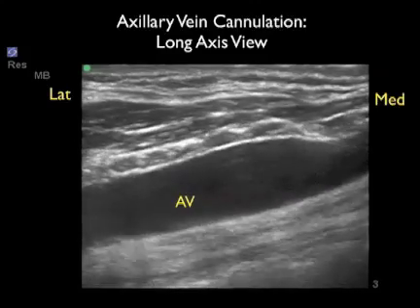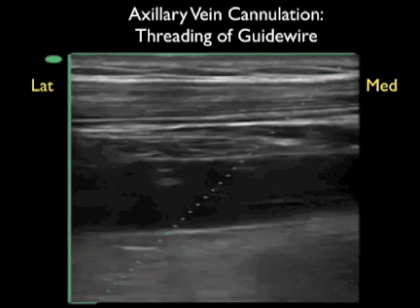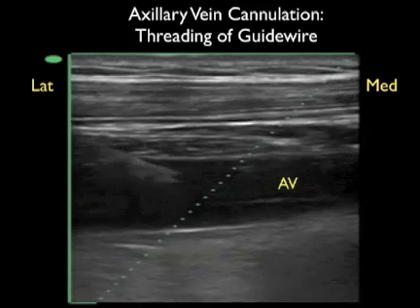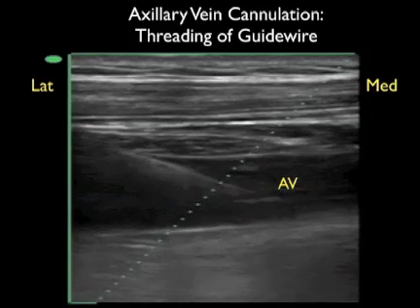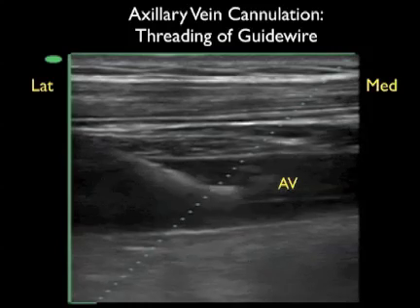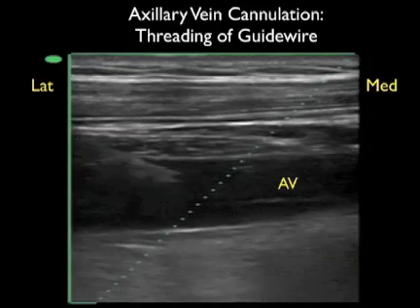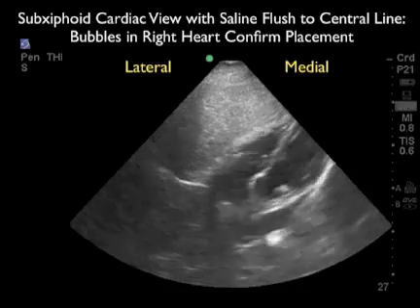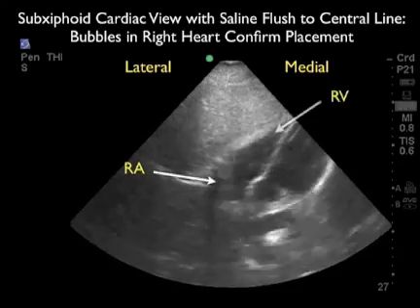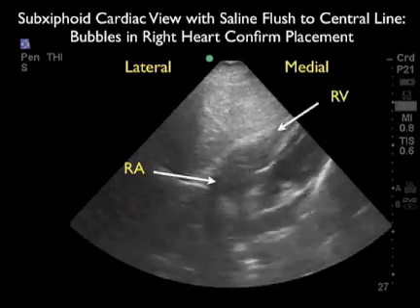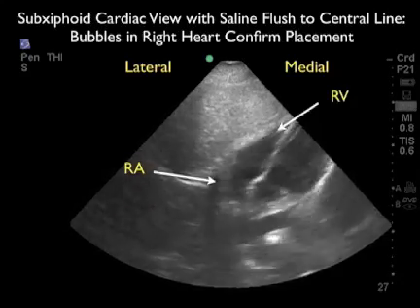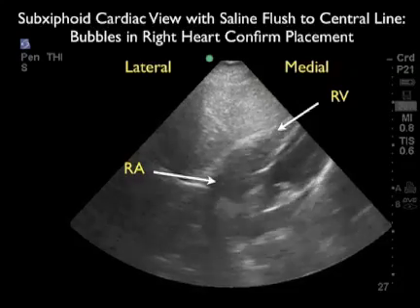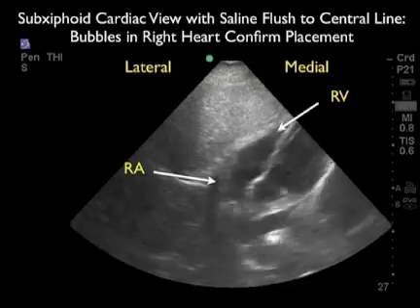The key teaching point is that the long axis view is great for assessing needle depth at all times. Another valuable use of the long axis technique is to confirm that the guide wire is safely within the lumen of the axillary vein — we can see the guide wire passing through the tip of the needle and moving down the axillary vein towards the superior vena cava. Additionally, a quick way to confirm catheter placement within the superior vena cava is to perform a saline flush: flushing saline into the catheter produces bubbles visible on the right side of the heart, confirming the catheter is indeed within the vessel lumen — a bedside check prior to obtaining a chest radiograph.